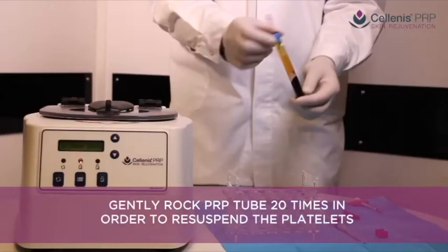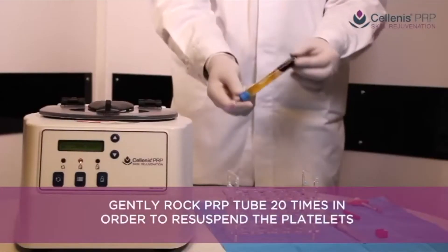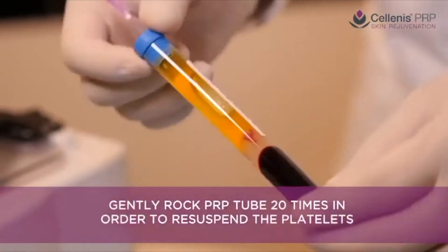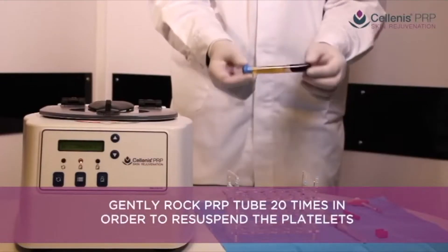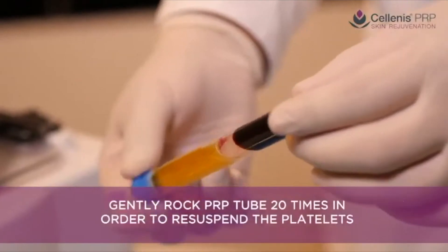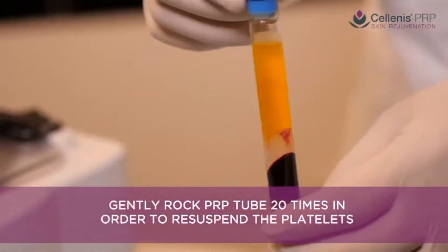During centrifugation, platelets collect in vast numbers directly above the gel. The plasma towards the top of the tube has very few platelets, described as platelet-poor plasma or PPP. An important step is to redistribute or re-suspend the platelets back into the plasma. This is achieved by gently rotating the tube to lift the platelets off the gel surface — rotate the tube at least 20 times or more.